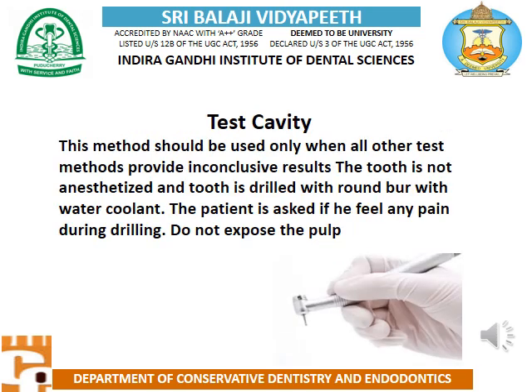Test cavity. This method should be used only when all other test methods provide inconclusive results. The tooth is not anesthetized and the tooth is drilled with round bur with water coolant. The patient is asked if he feels any pain during drilling. Do not expose the pulp.